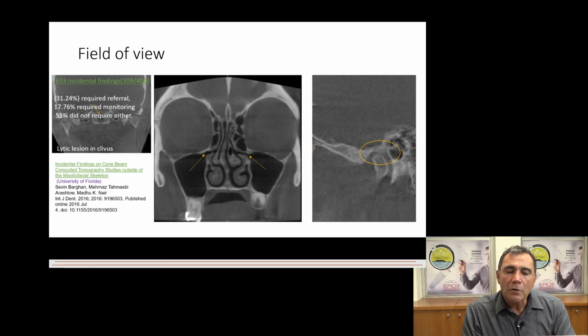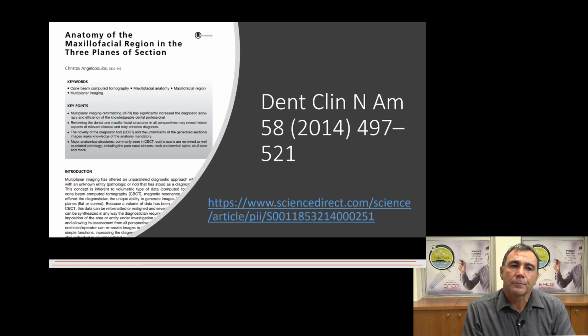So if you cannot interpret these views, do not take them. In fact, in my own practice, I keep it down to 10 by 10, because it's the anatomy that I use every day, and I can easily interpret these results.